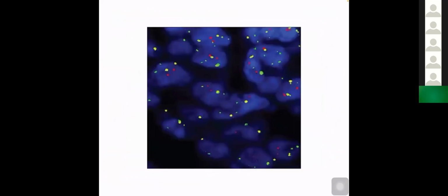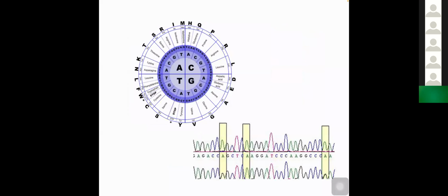When we talk about digital pathology, though, we're also talking about other forms of digitization of images. So for some while now, we've been digitizing electrophoresis gels, northern blots, western blots. We've also been digitising FISH and using image analysis on that to help us highlight chromosomal issues. We've also started to digitise our tracking systems, barcoding of blood tests, and given that we do, certainly across England, we're probably using 1.7 million blood tubes a week, an enormous volume of data that's flying around the system within our digital pathology environment.